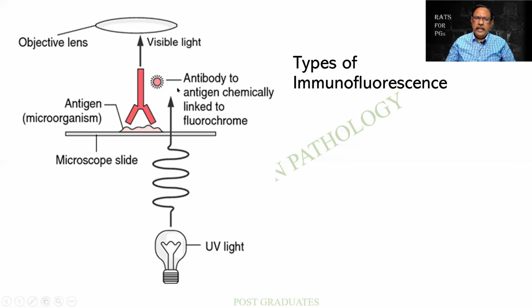This substance is illuminated by means of a UV light or any other source of illumination, as we shall be seeing. And finally, the shine that is seen in the material is visualized. Generally, in a microscope, we see with the eyes, but here there are other modalities. So we shall have this in mind.